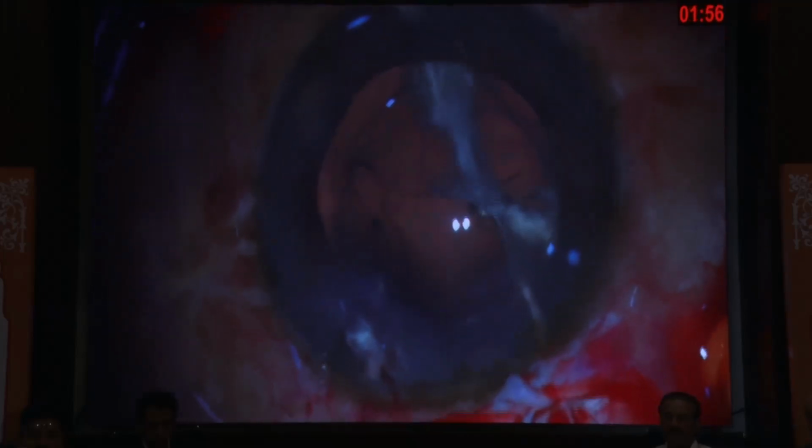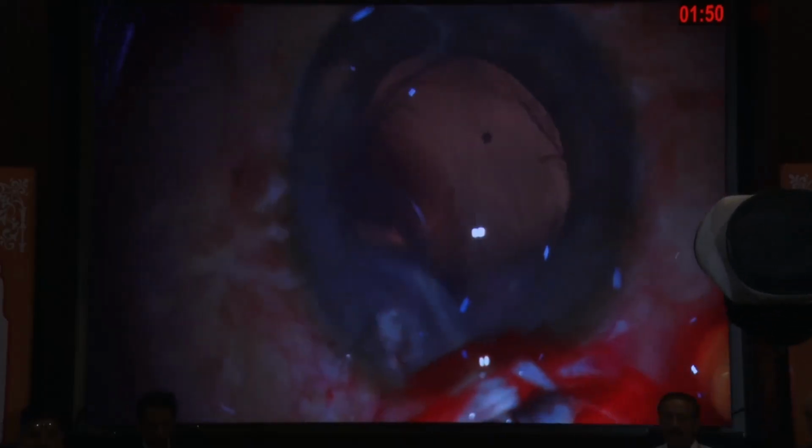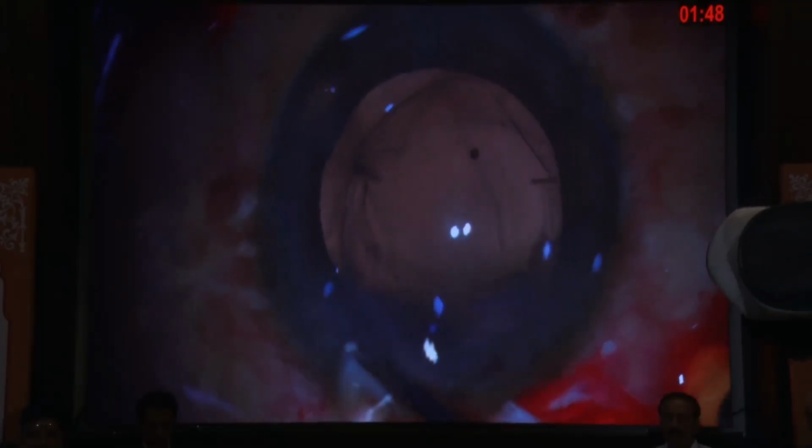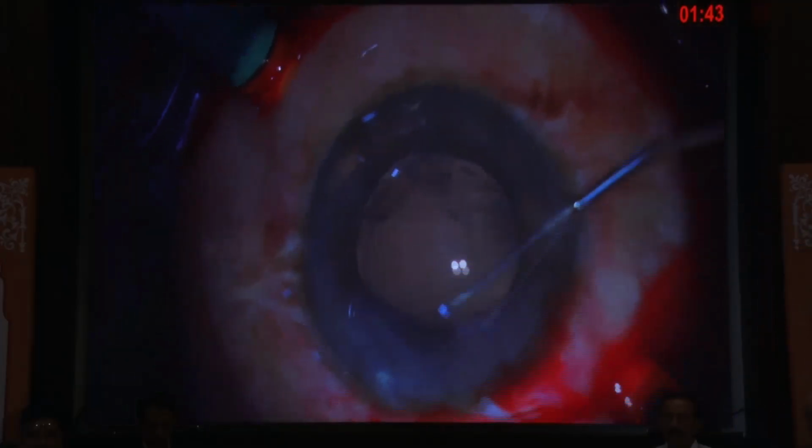That's what I said, because there are studies that say when you do the pars plana, your vitrectomy time is shorter, it is safer, and that's all the vitreous you have to cut. You don't have to cut more than that. And in this particular case, the entire rim was there. So just going back and rechecking.